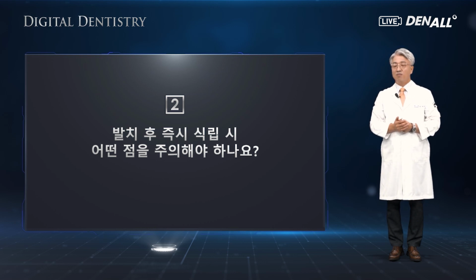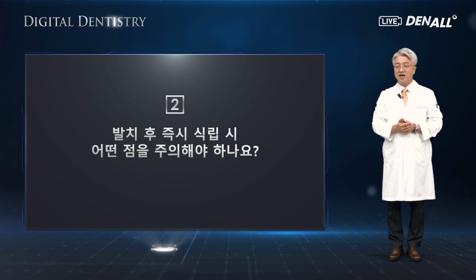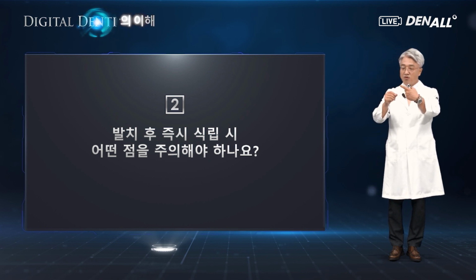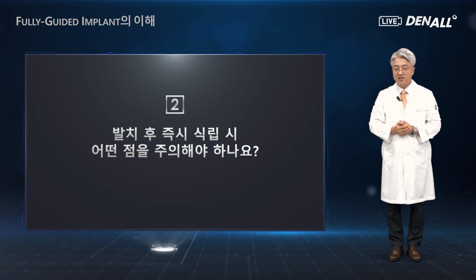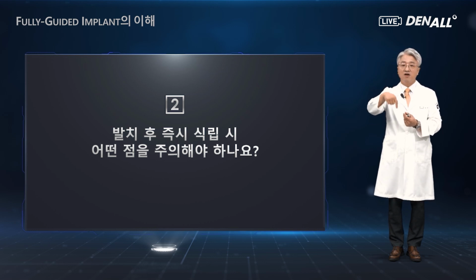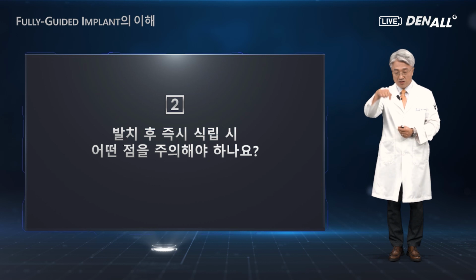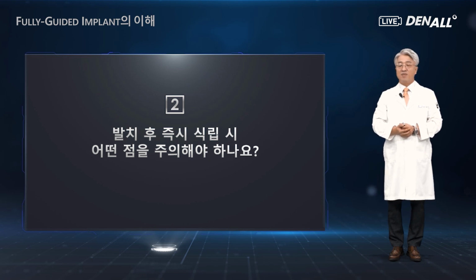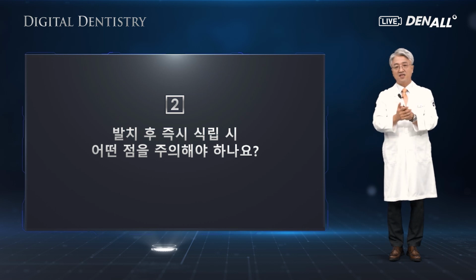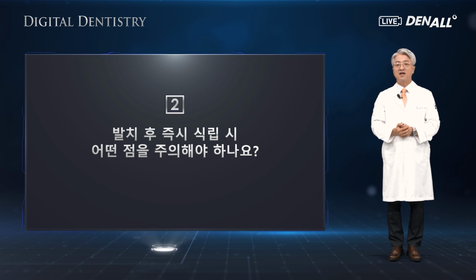In that case, a bone flattening drill can be used, or to prevent the slipping of the drill, you can apply force in the opposite direction, or you can use a path drill from Ostem. The drill doesn't slip as it is designed that way, so that the drill direction is as planned and does not deviate from the plan. That's the most important thing when you do the immediate placement.